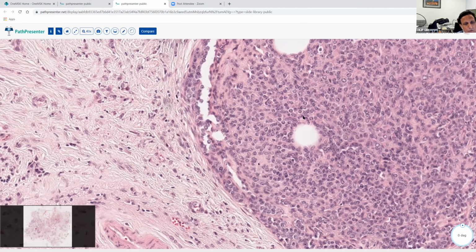And then, of course, when you do E-cadherin and P120 stains, you will recognize that there are a lot of cells that are not staining with these immunostains, and they correspond to the LCIS. Now, there will of course be a lot of ductal cells in a hyperplastic duct, but as I said earlier, the morphologic determination that these are benign will help you ignore all that noise.